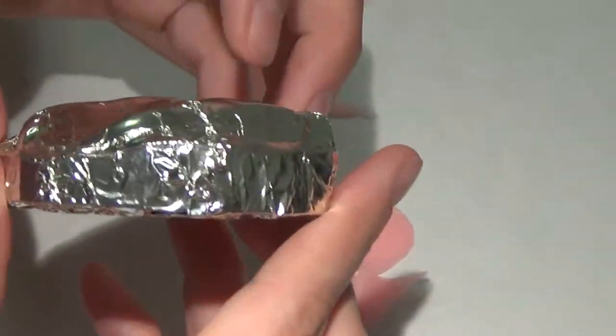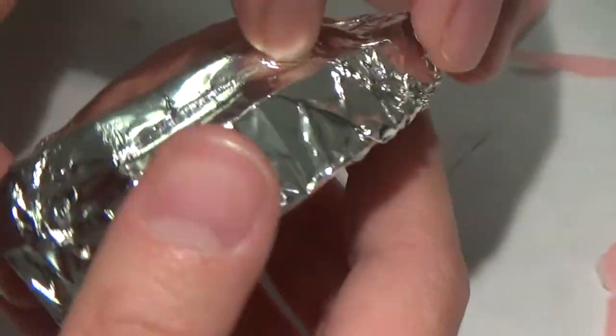But what I want to see is I want to see all of these borders. I want to see the contours and surface area of the wax that I just did. So when you look at this, you can see the anatomy or the contours, that ledge of wax. You can see my stop. It's well adapted to the palate.